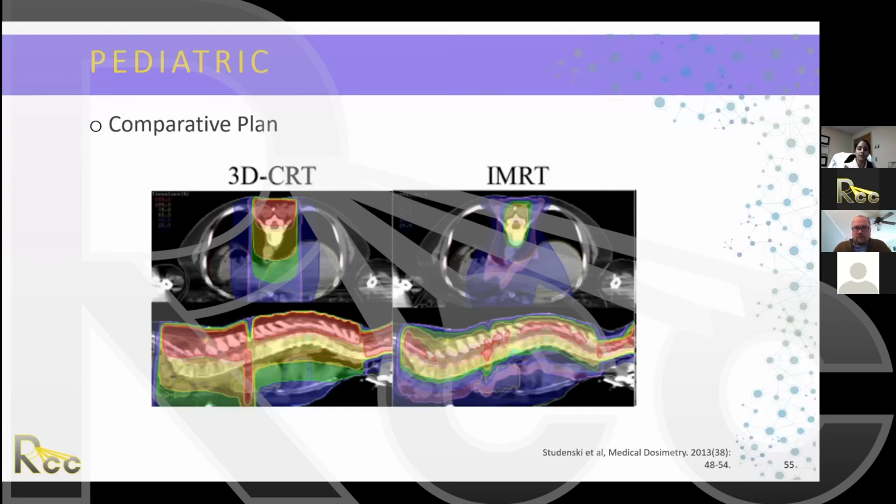And then the area that's further away, take it to a slightly higher dose. So it just kind of depends on the scenario. But usually, as a rule of thumb, you need at least 5 millimeters to a centimeter for appropriate dose falloff. And sometimes, depending on the scenario, if the tumor is so close to critical structures, even if you have a PRV, it's not necessarily attainable. In that type of scenario, I would consider doing some type of dose painting and then try to escalate what I can to that highest dose safely.